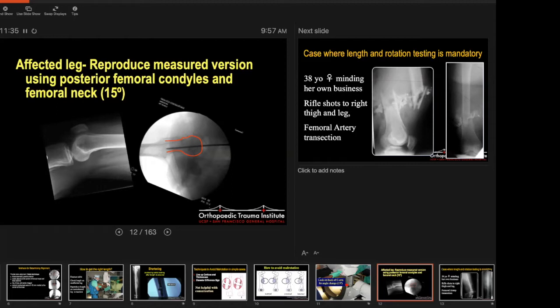Don't get fooled by one thing: remember that the femoral neck is an anterior structure — a little bit anterior relative to the shaft of the femur. You can still get a good lateral; just make sure whatever you're seeing on the non-broken side, you need to recreate on the broken side. It's good to save those images.